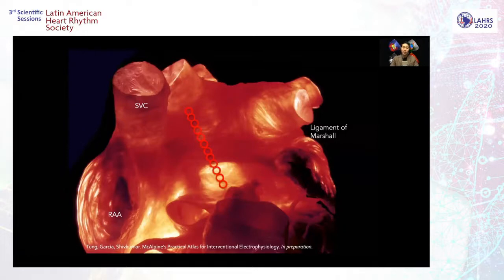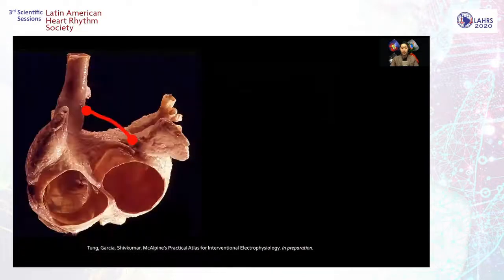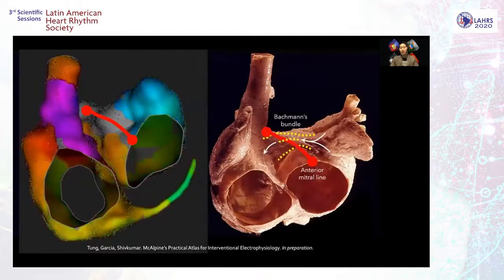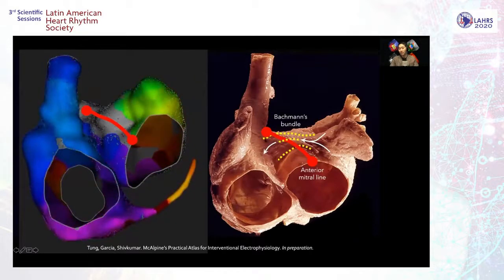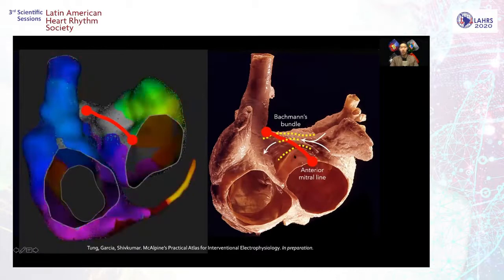This is a putative mitral line, and you can see what you're dealing with on the transillumination. Bachmann's region can be a barrier and serves as a 3D barrier there. So here would be the bridge. This is the activation. And again, this is how the anatomic correlation would be, that you've got these dedicated epicardial fibers that can then continue the signal across, even though the endocardium is blocked.